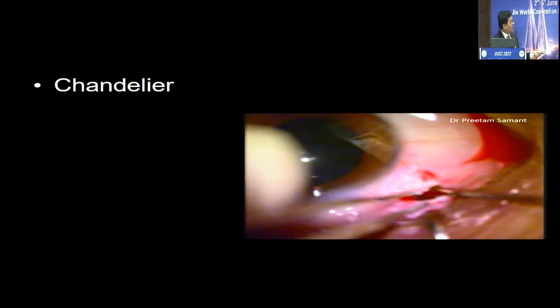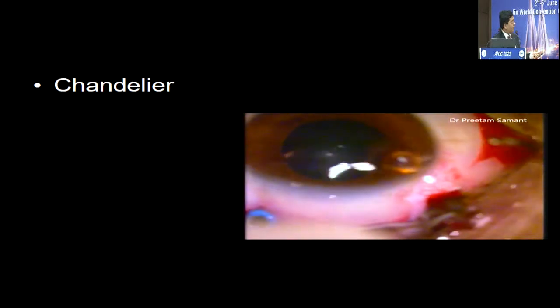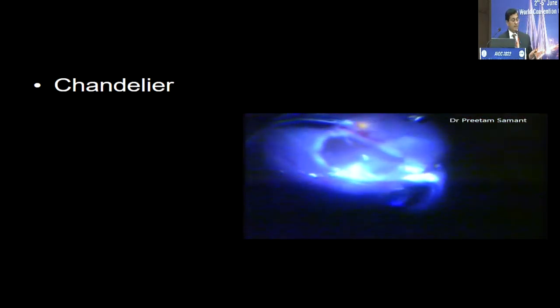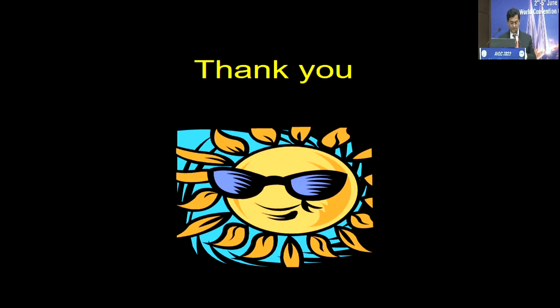There's the foreign body coming out. I've extended my sclerotomy, removing the intraocular foreign body. And then I tackle the remaining retinal detachment by doing laser and putting silicone oil. That's the huge place where the foreign body was impacted. So this is the kind of success we achieve with these modern vitrectomy instruments. That's the end. Thank you.